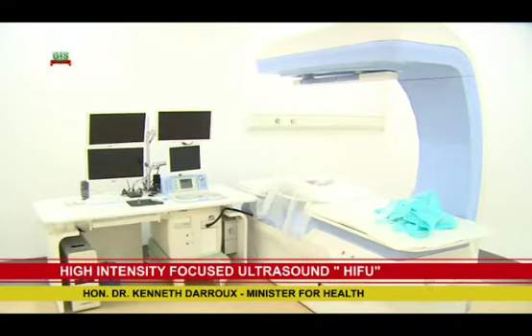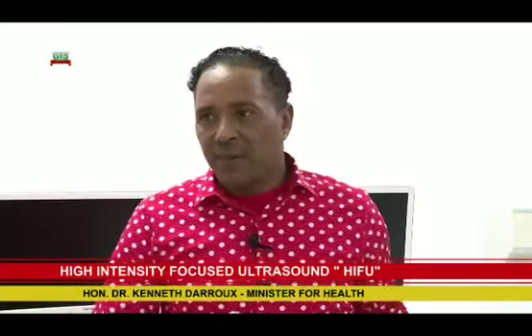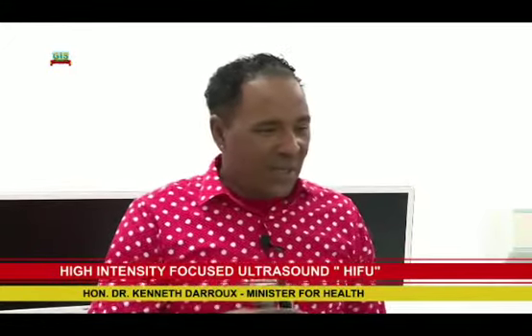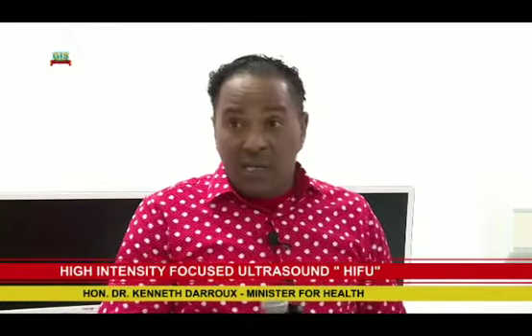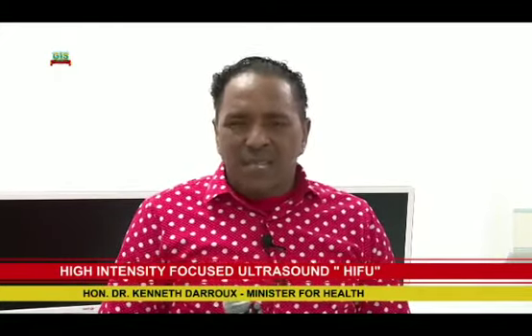If I may take you back to your childhood, when, back in the countryside, we would use pieces of glass to reflect the rays of the sunlight onto a piece of paper or some dry bush, and in some cases you would start a fire. This is the same concept, but instead of using light, you're using invisible ultrasound waves, and you focus them into an area. Now, the intelligent thinking ones among us can begin to say, well, yes, if you can focus this energy somewhere, there should be some medicinal use for it. So the main use, as I'm sure you would have found out, would be to treat tumors, both benign tumors and certain malignant tumors, especially prostate cancer.